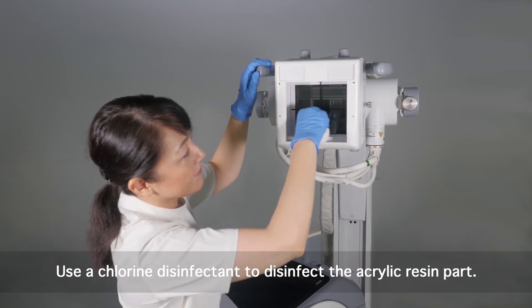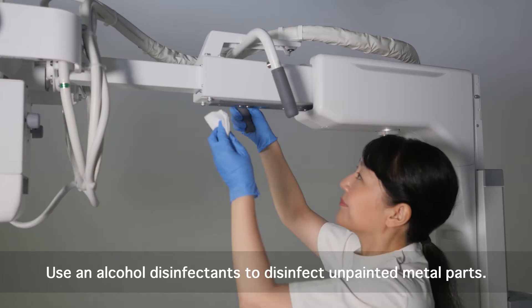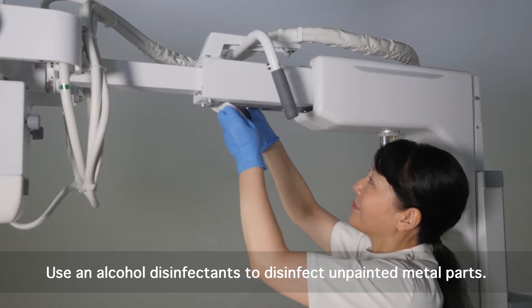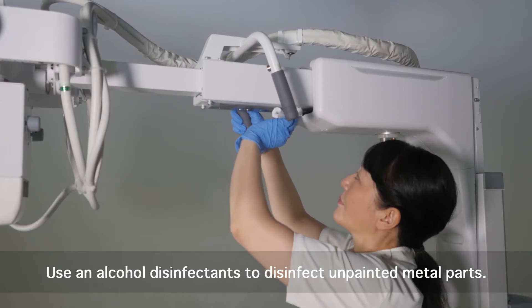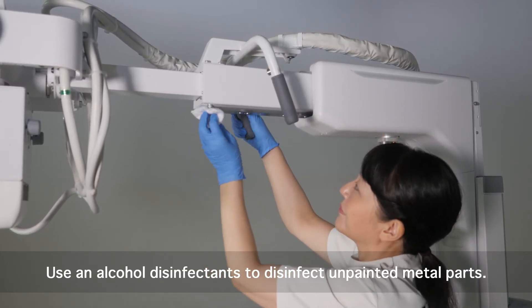If alcohol disinfectant adheres, it may become deformed or cracked. Use an alcohol disinfectant to disinfect unpainted metal parts. Use of chlorine disinfectants on metal parts can lead to corrosion.